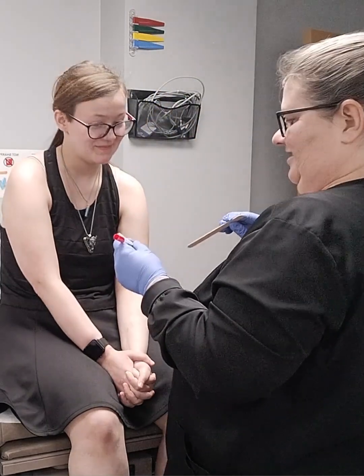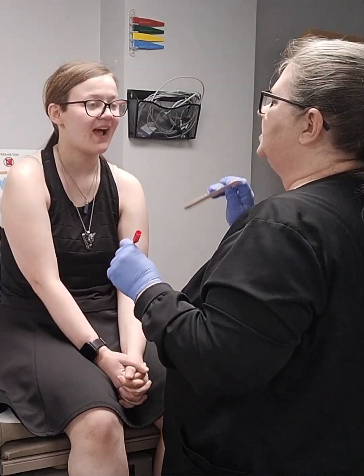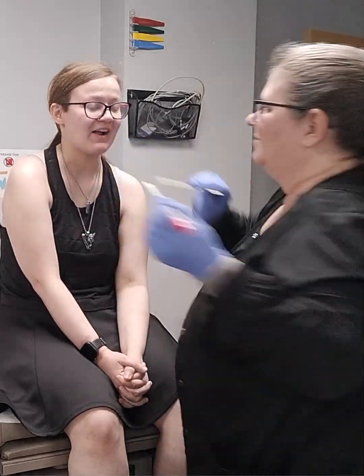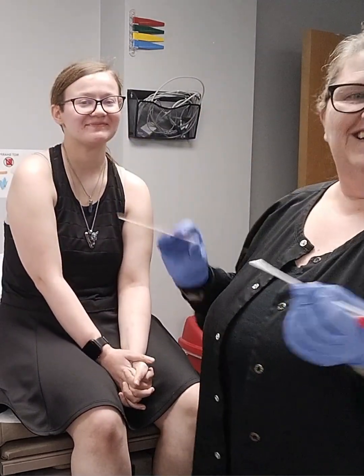Are you ready? I am ready. Okay, so here we go. Go ahead and open your mouth, stick your tongue out, and say 'ah' for me. All right. Perfect. And she didn't gag.